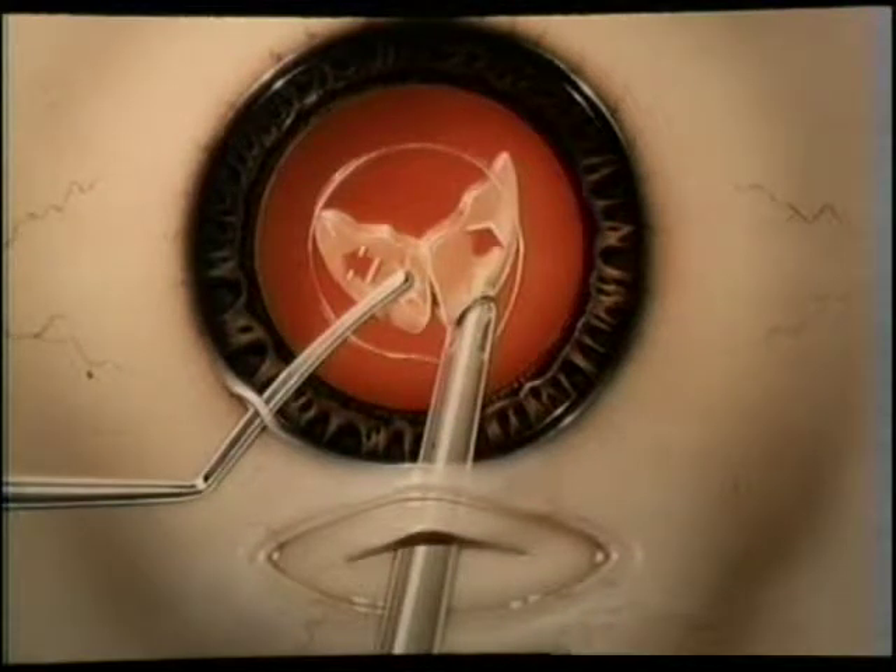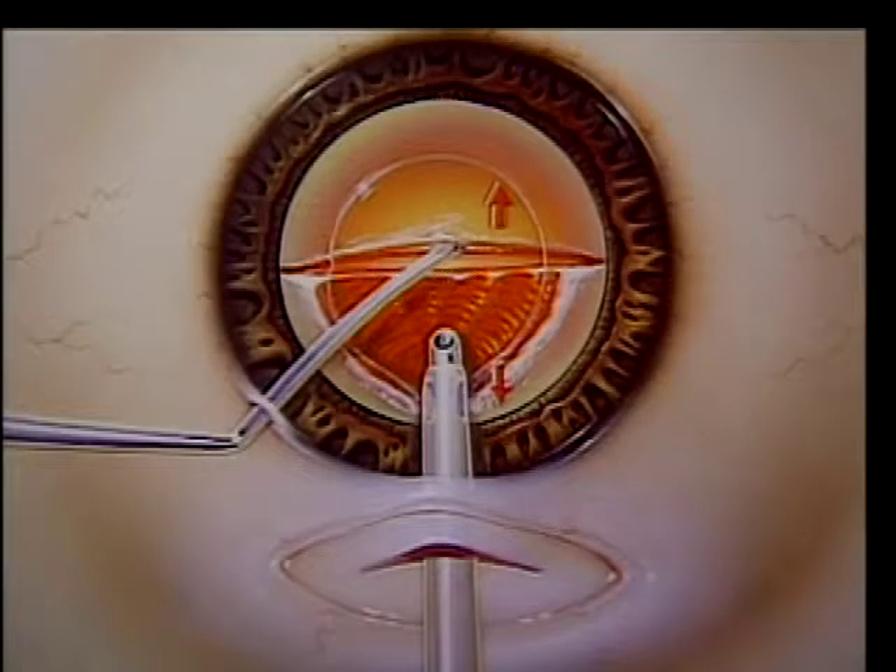The remaining right-hand section of the nucleus is then maneuvered with the second instrument and brought to the mid-pupillary zone, and a final split is made after impaling the tip with a short burst of ultrasound and breaking away a section with the spatula. Alternatively, after sculpting the upper portion of the nucleus, it can be stabilized with the phaco tip and then the spatula pushed inferiorly to create this split, and then the inferior portion of the nucleus can be divided into sections.